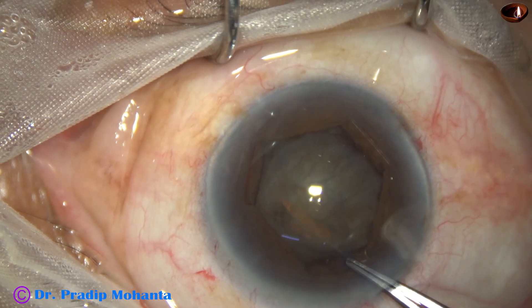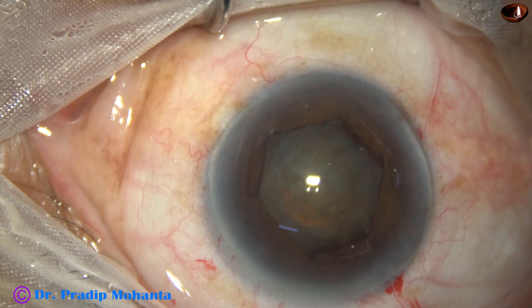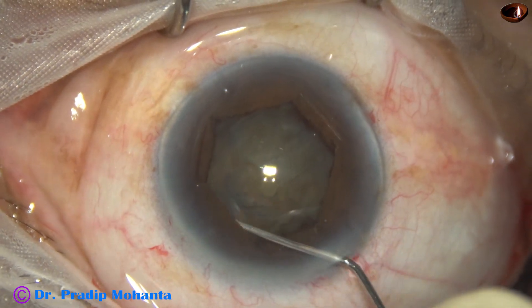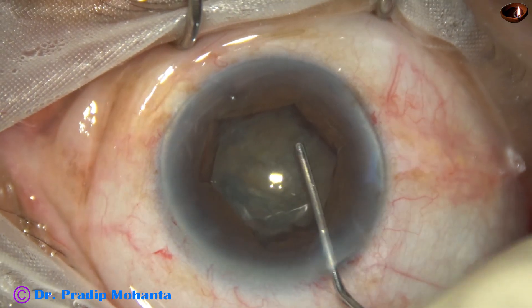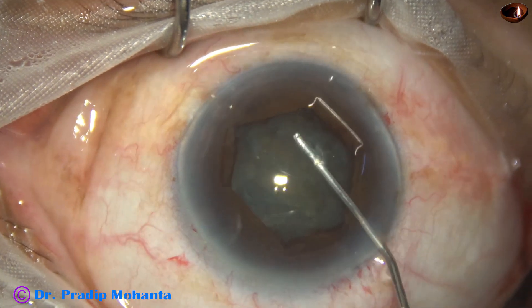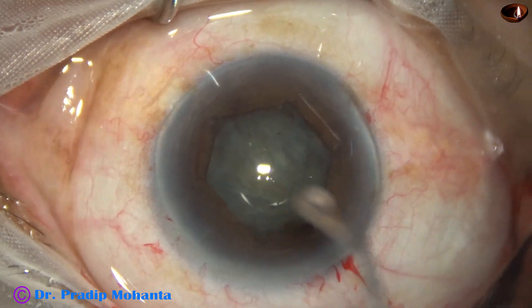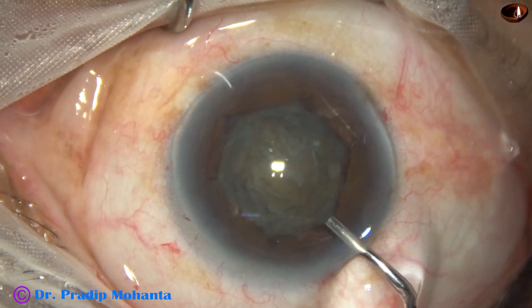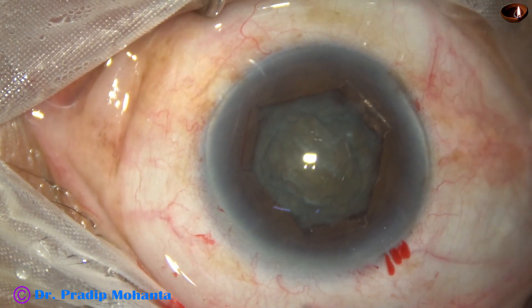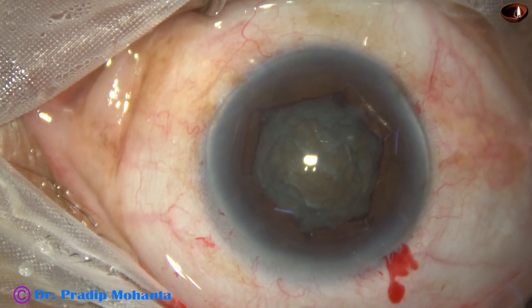There is some vitreous upthrust in this case, probably because of the peribulbar block, which is why the viscoelastic is leaking fast. Hydrodissection is done, and now I inject viscoelastic again and go into the anterior chamber.